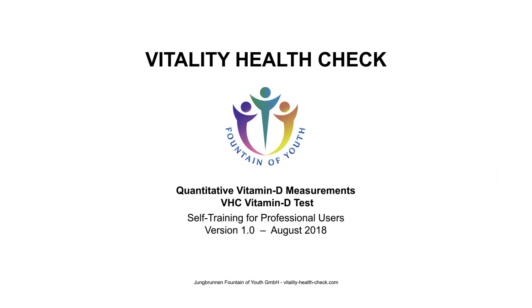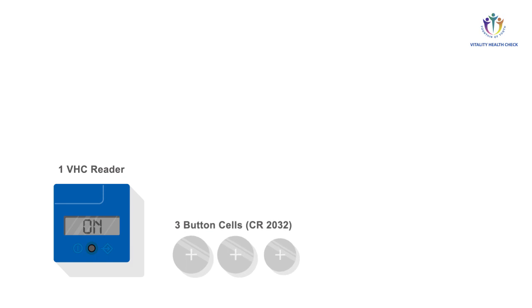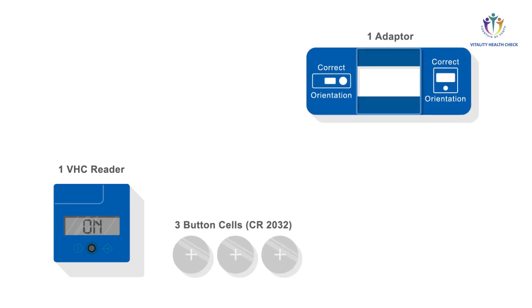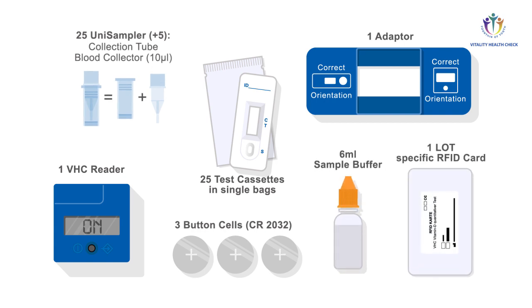VHC Vitamin D test components provided to perform quantitative vitamin D measurements: VHC reader, three button cells, adapter, VHC vitamin D test cassettes, unisampler, sample buffer, and lot specific RFID card.